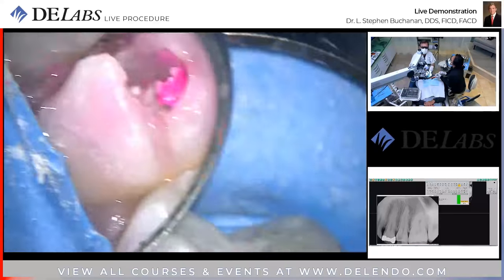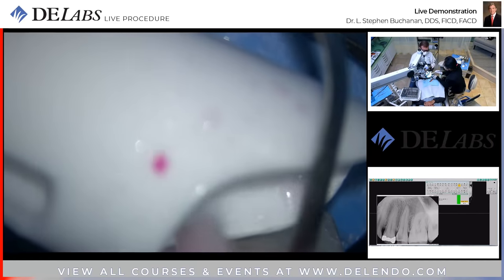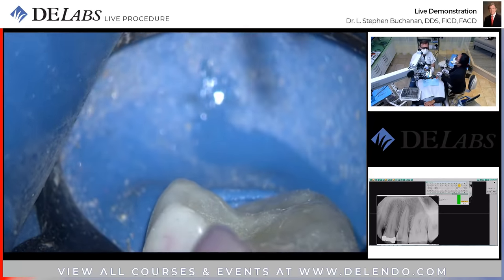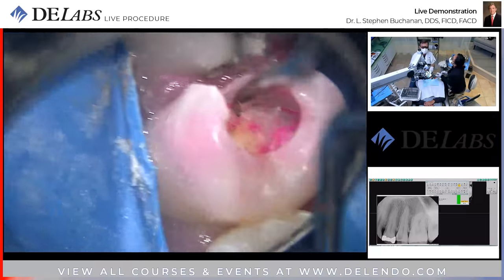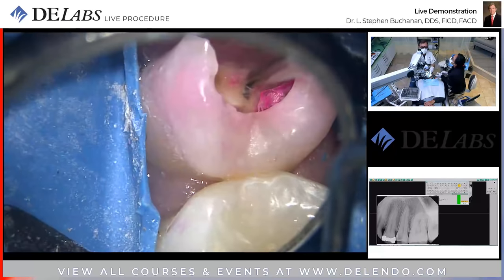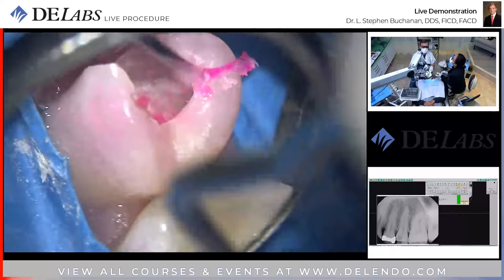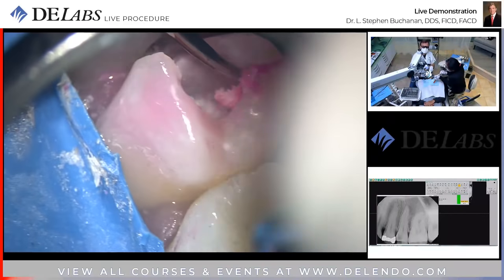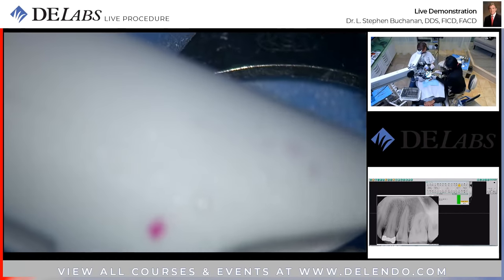Like a sharp spoon. I guess I'm like every other dentist doing a root canal today. When I get through the access, I get in the root canal and do something really interesting.